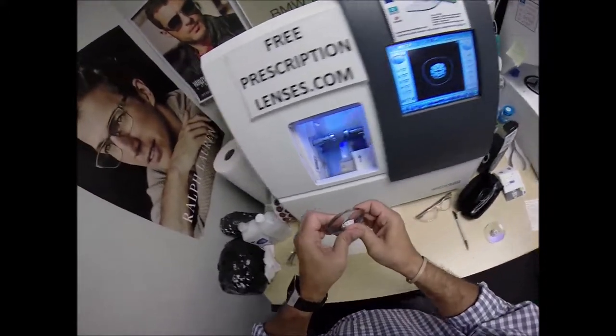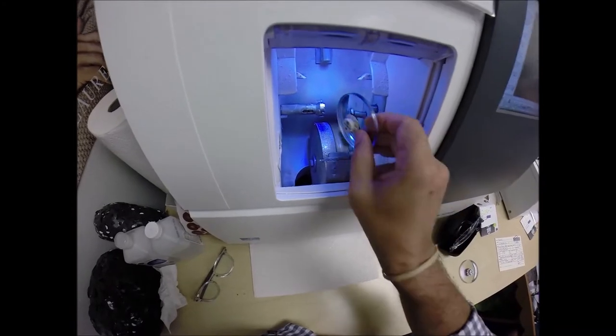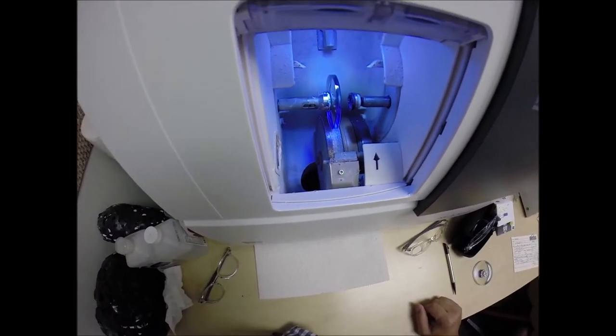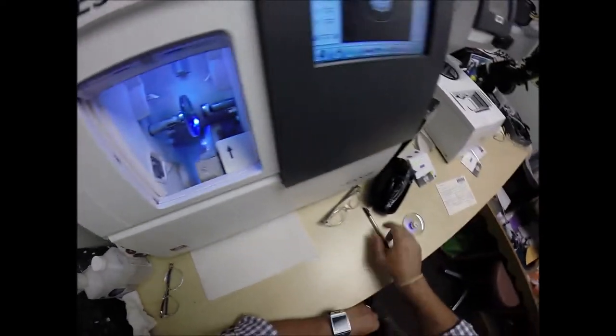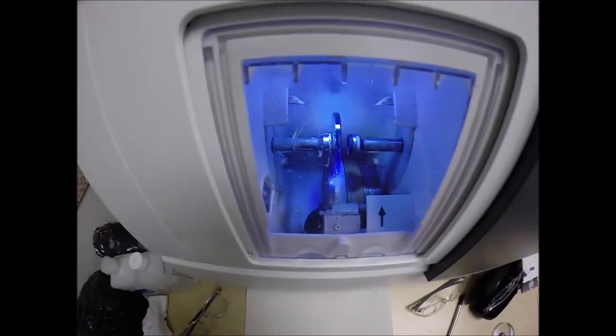Now, place the magnet and press that on there firmly. It's going to do a job a second time as it attaches itself to another magnet there in the chuck, or as I like to call it, the Charles, because I just don't know this machine well enough to call it chuck. Hit the green start button. The door closes. The clamp shuts.